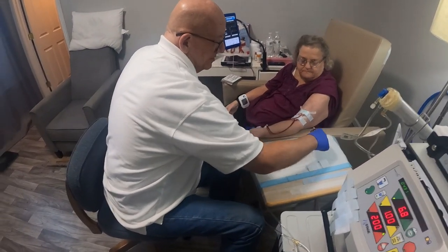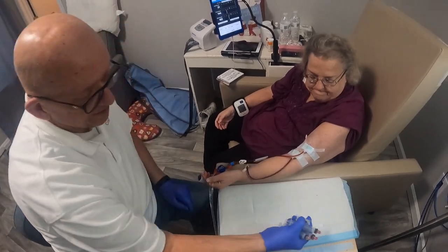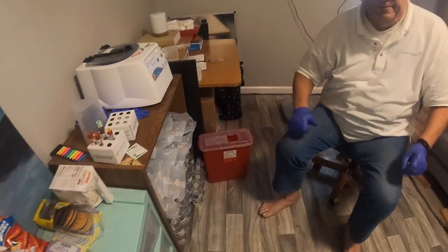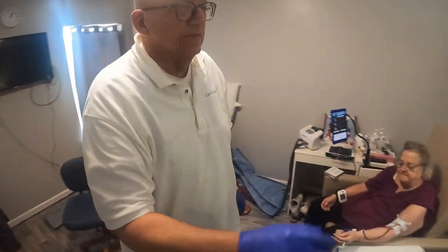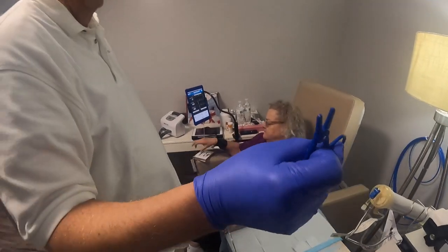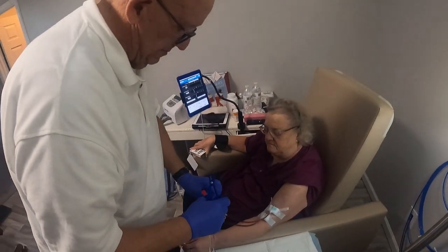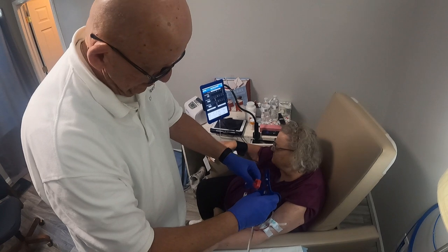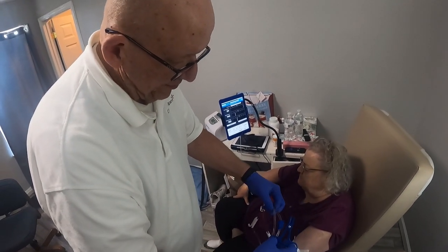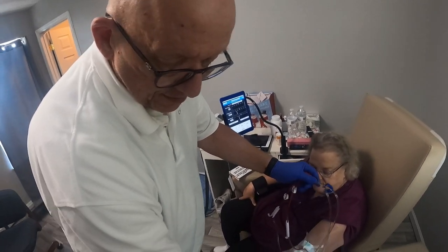So this whole time you saw me stacking stuff in one place, just so I can reach over here and pick all this up. Sharps container. Secure lines, leave loose loops. So these lines, you want to sort them out. And the blue line will be shorter because it's on the inside. So I need to pull these just a little bit.